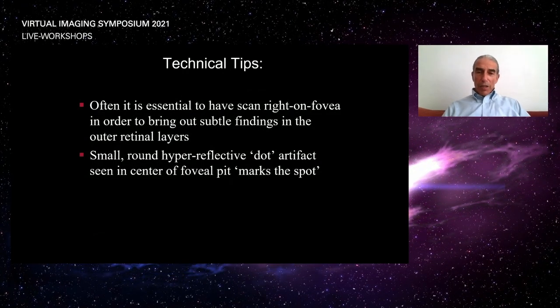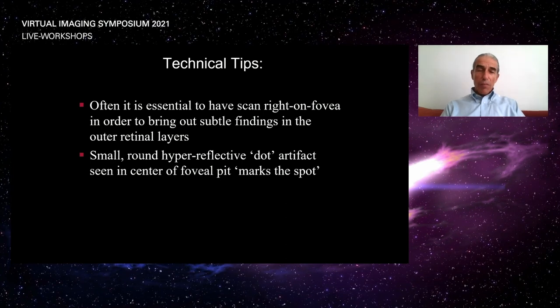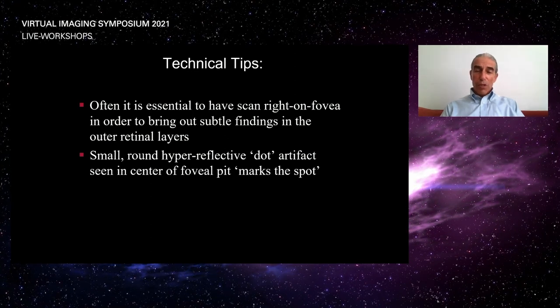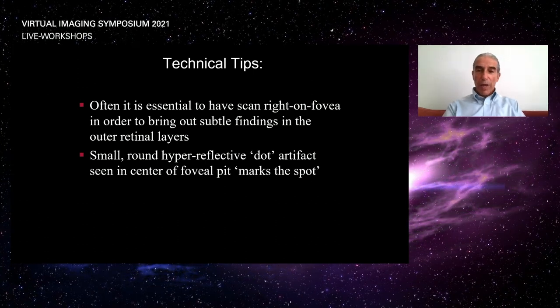I'd like to share a few technical tips, seeing this is our technical session. Three to be exact. First of all, when looking for small, minute changes with the OCT, it's important to be right on fovea with your scan. Being right on fovea enables you to find the smallest changes in the deeper retinal layers.